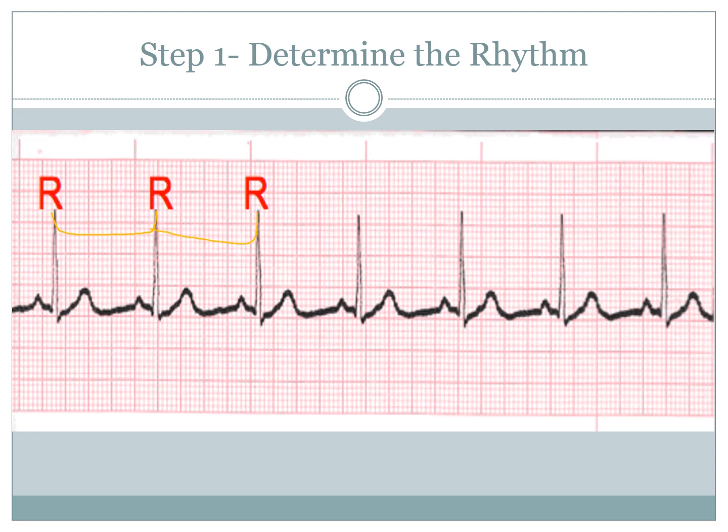Every time something happens, like you breathe in, your heart rate increases. When you breathe out, your heart rate decreases. Technically, when you look at the ECG, that is what's known as an irregular rhythm, but it happens all the time. There's no negative outcome, so it's regularly irregular.